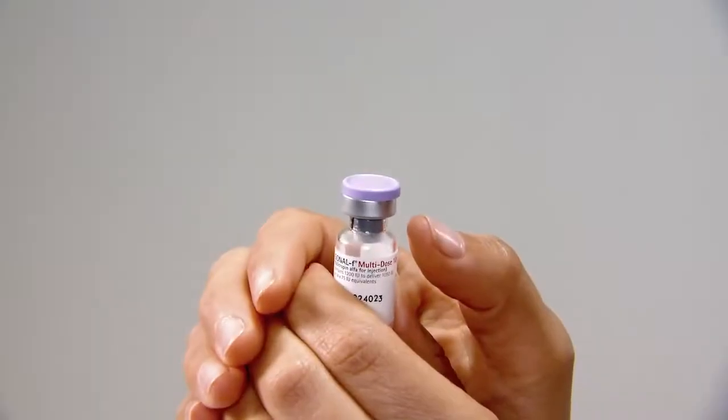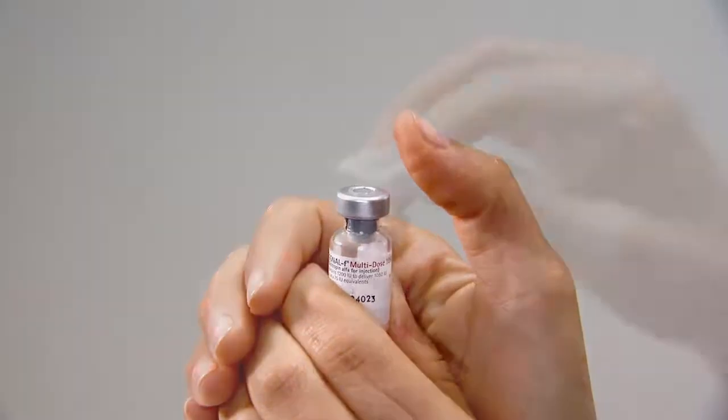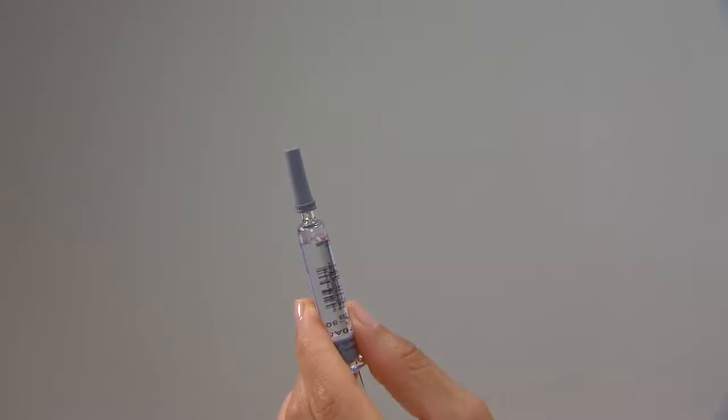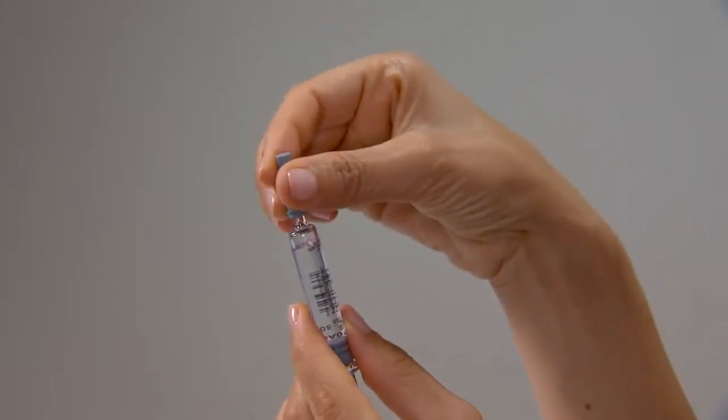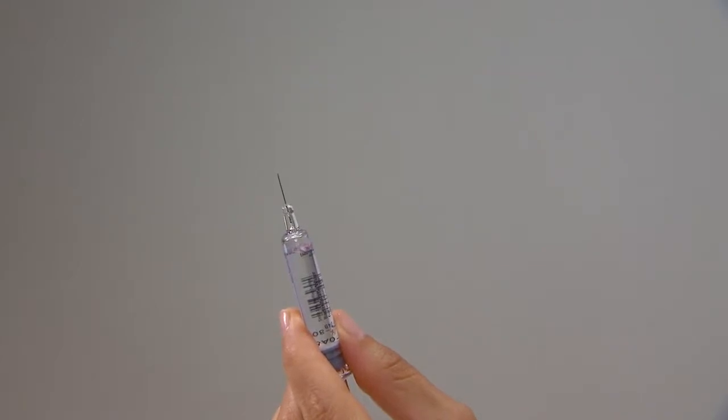Step 1. Mix. Using your thumb, flip the protective plastic cap off the Gonal-F Multidose vial. Wipe the top of the vial with an alcohol swab. Carefully twist the needle cap off the syringe labeled bacteriostatic water for injection USP. Do not touch the needle or allow the needle to touch any surface.